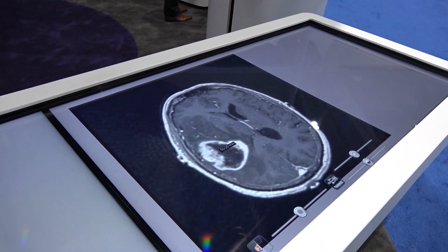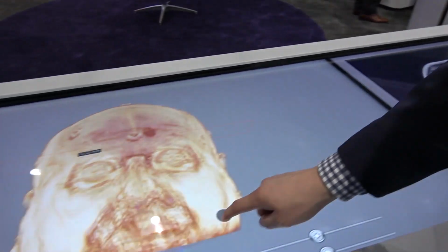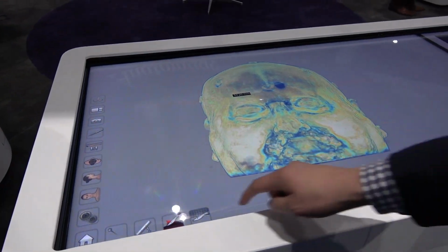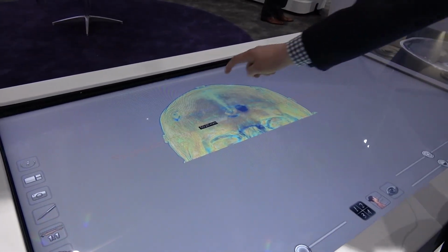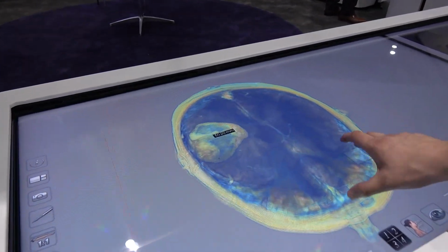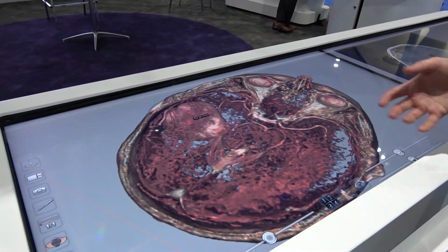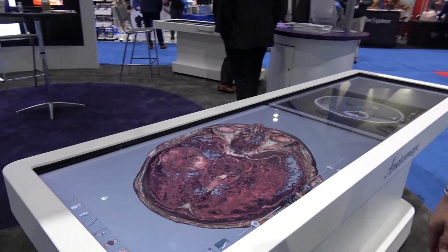So we've measured that. We've done a measurement of 50 millimeters, and we're going to go back and change this 3D model. What we're going to do is apply a transparent MRI render. And we could interact with this similar to the cadaver. And we've made a couple cuts, and we should be able to see that measurement populate in 3D here. And you can see that 50 millimeters across that. So we have several clinicians and simulation labs using this clinically and uploading real patient data.